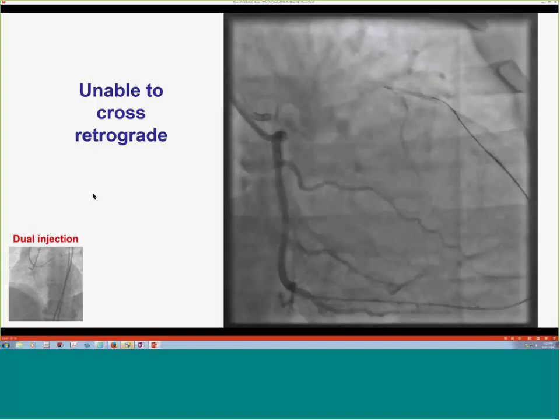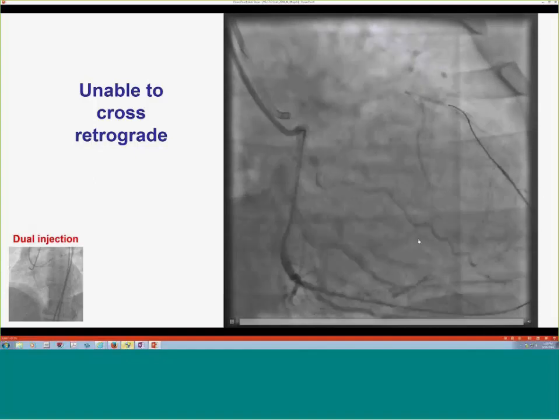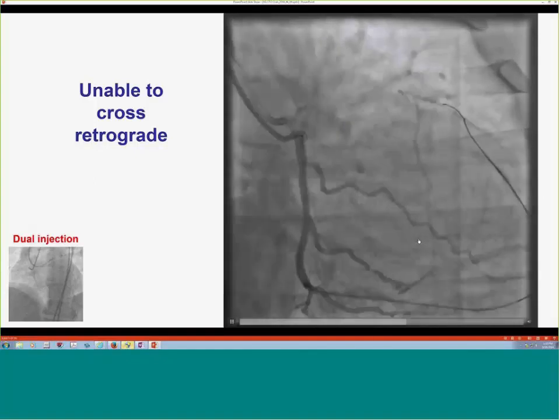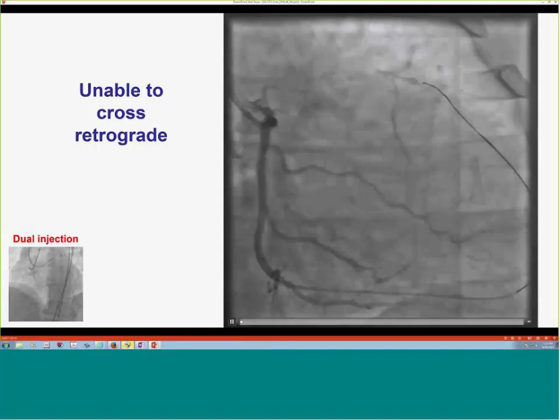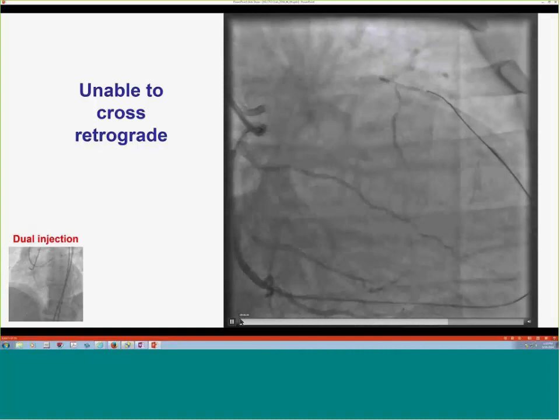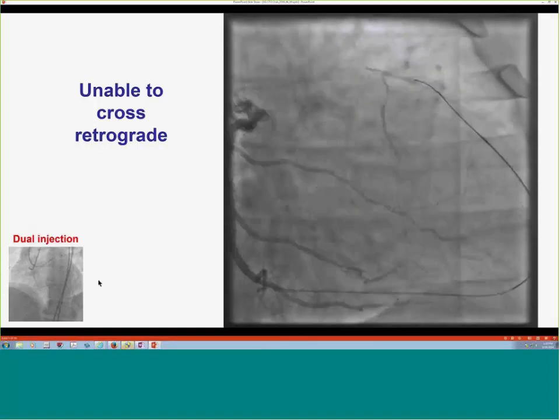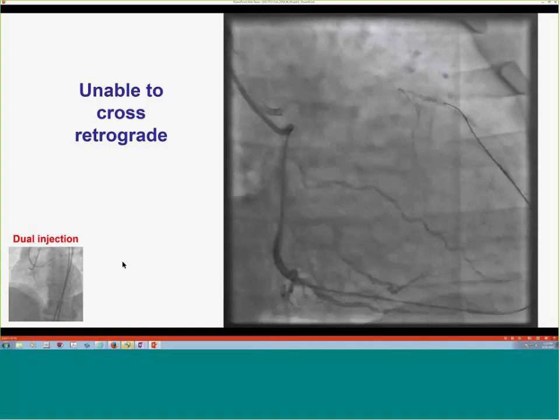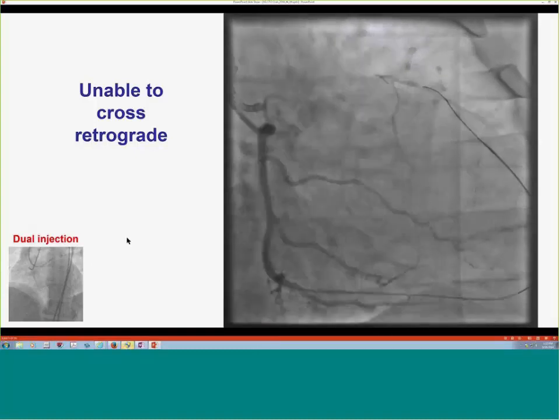What do you think of that septal there? From my computer, it would appear to be a reasonable target for a retrograde case, but I don't know if that's true. It's in between the first and the second CTO, there is a septal that has a continuous communication. It may be an RV marginal there. It may be an epicardial. I don't see it well, but.